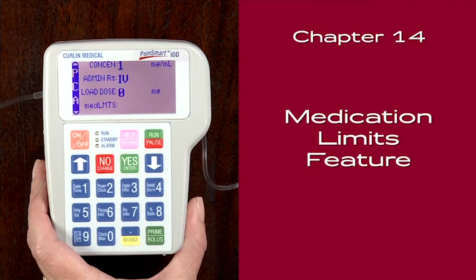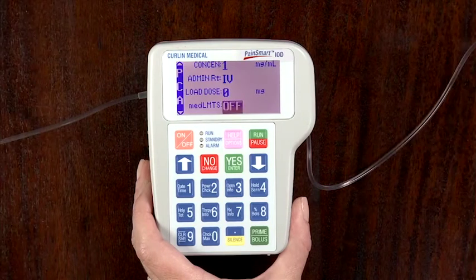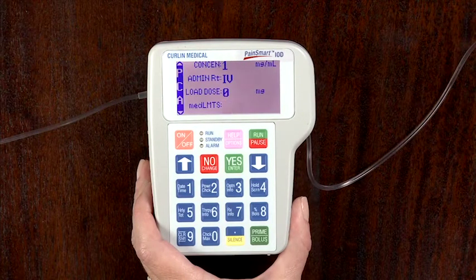Chapter 14, Medication Limits feature. Setting medication limits. The Med Limits feature allows maximum amounts and minimum intervals to be programmed as an added safety measure. This feature may or may not be used in your institution.